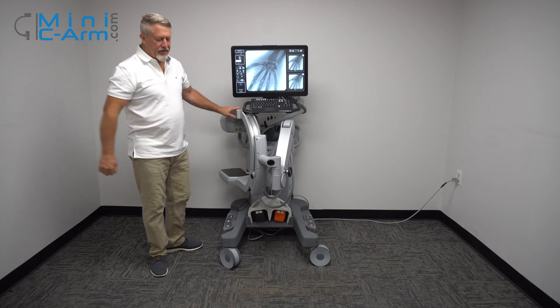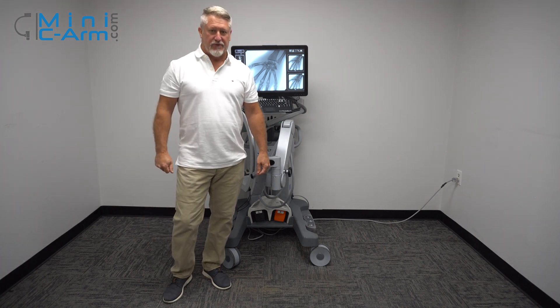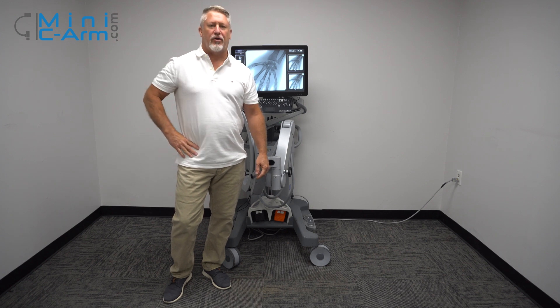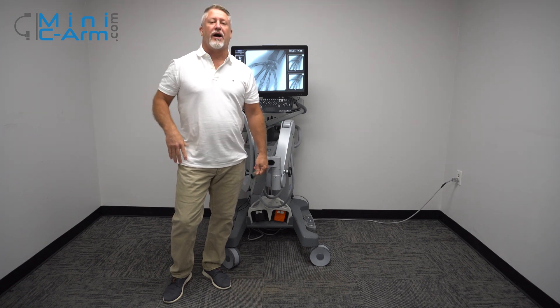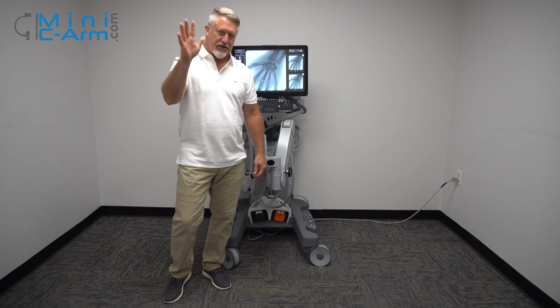This has been an overview of the OrthoScan FD Pulse. If you're looking for sales or service, please give us a call at 800-643-2998 or shoot us an email at info@minicarm.com. Thank you.